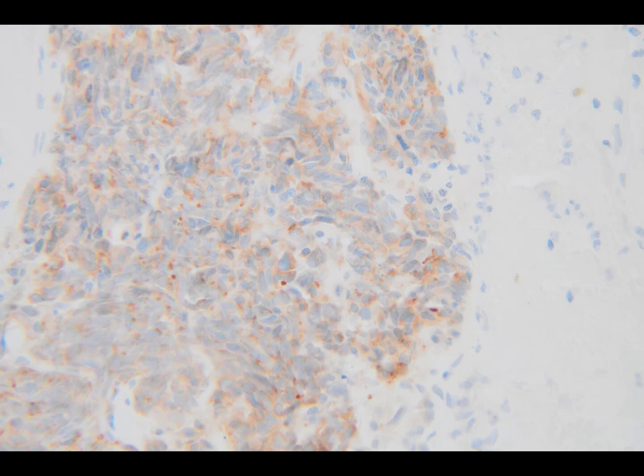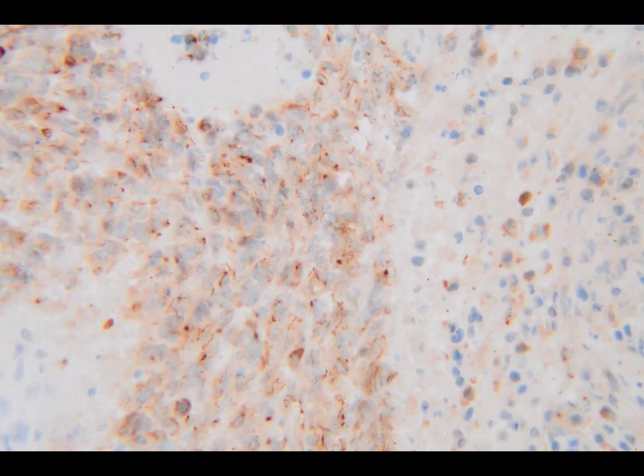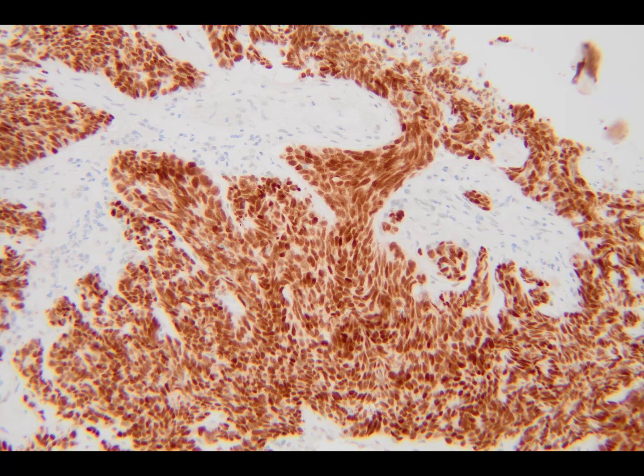Immunohistochemical studies are performed. The tumor cells are immunoreactive for cytokeratin 7. Notice the unique dot-like pattern of expression adjacent to the nucleus. This is referred to as a Golgi pattern of expression and is a feature of neuroendocrine carcinomas. The tumor cells are strongly immunoreactive for synaptophysin and TTF1. These findings support this as a metastatic small cell carcinoma of lung origin. In this case, the patient did not have a known history. After the craniotomy, the patient was scanned and a lung mass was found.